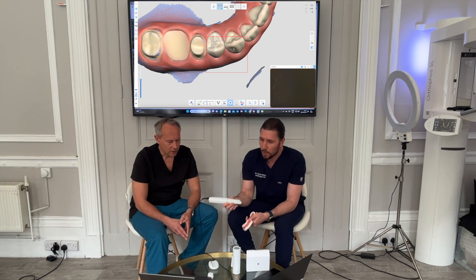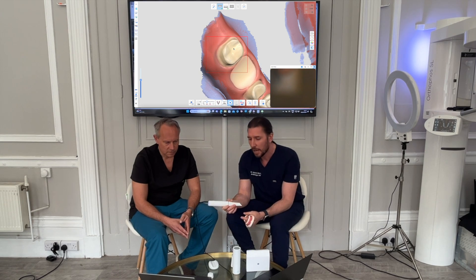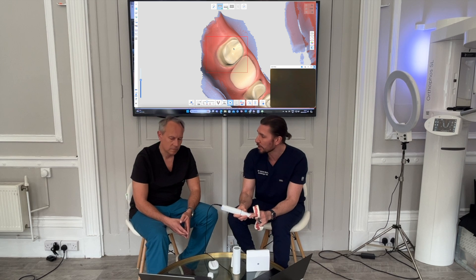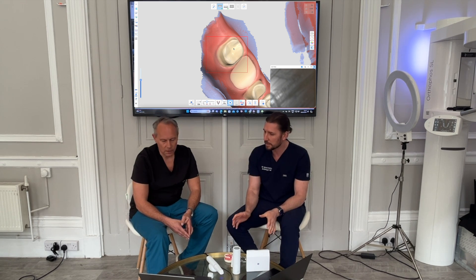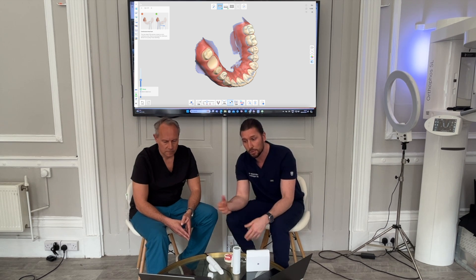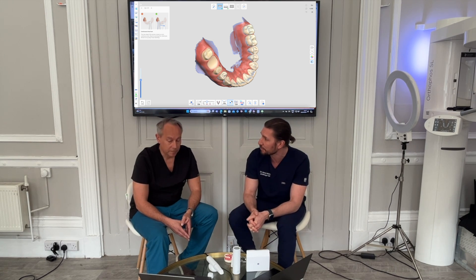We've still got the option of the regular scan head — it's not obtrusively big — and we can swap to the small tip if we need to get around, say, the upper retromolar area. There's also the nice stylus holder so everything is self-contained. It's pretty much the same Medit system otherwise; nothing fundamentally new in the software, but the same good familiar feel, just a new faster scanner with a few extra components.